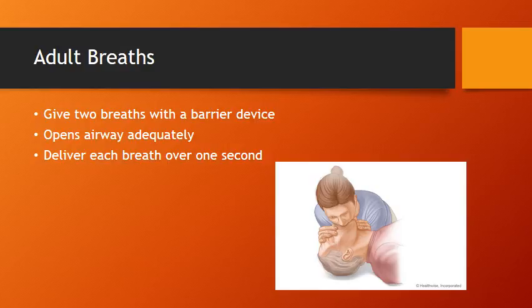We also need to avoid excessive ventilation. Dwight and O'Neill state excessive ventilation can cause a victim to vomit if air is delivered into the victim's stomach instead of the victim's chest. Next, we need to resume chest compressions in less than 10 seconds.